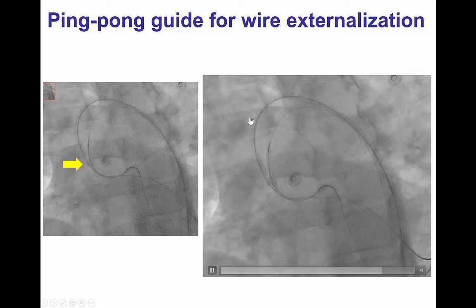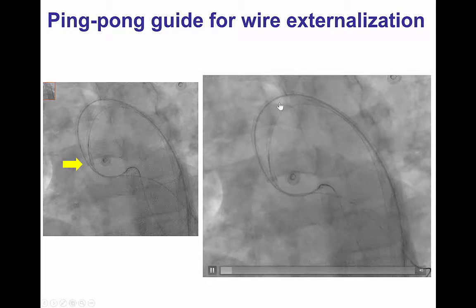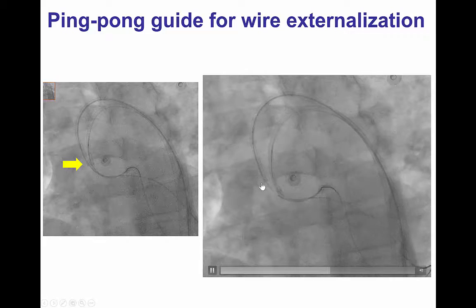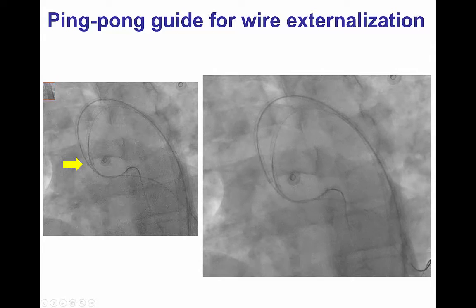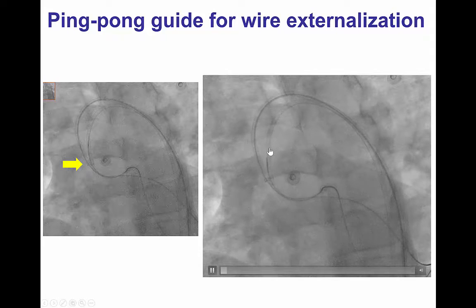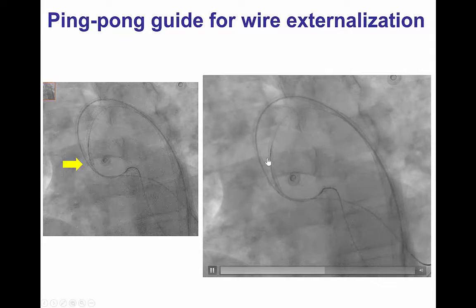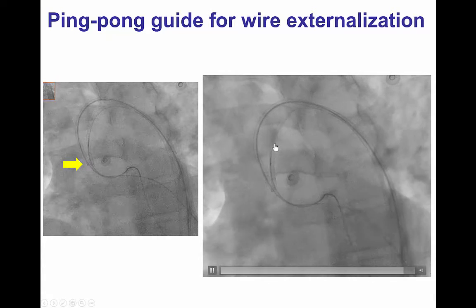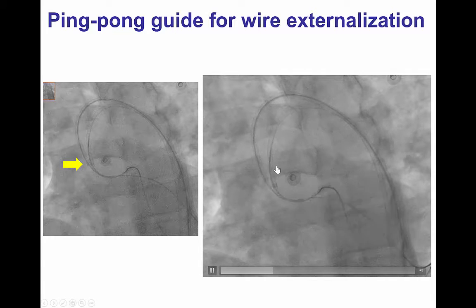We used the so-called ping-pong guide technique, which essentially means there are two guides engaging the same vessel. Here is the initial guide catheter through which the Corsair catheter is advanced. It goes into the LAD and then through the collateral into the second obtuse marginal and then through the circumflex back into the left main. The Corsair is then advanced into the second guide catheter, which minimizes tight space and interaction between the two microcatheters.